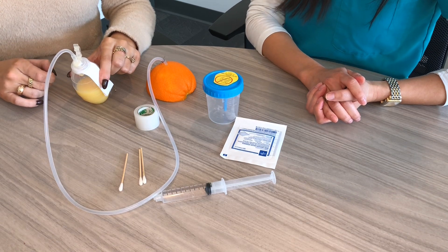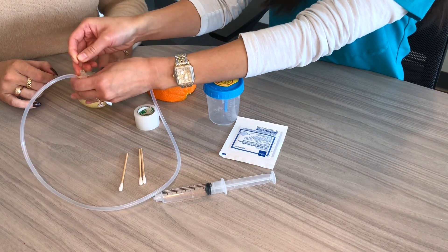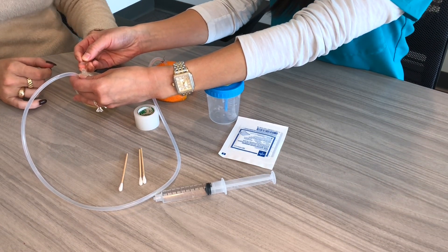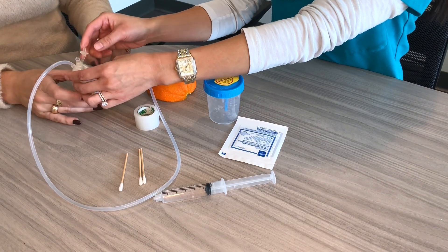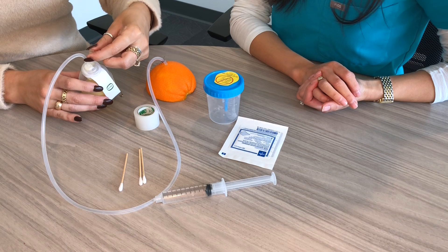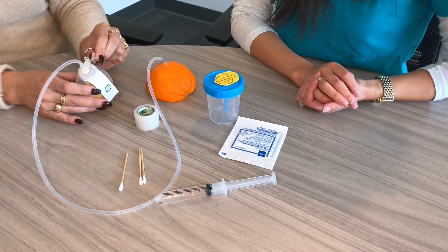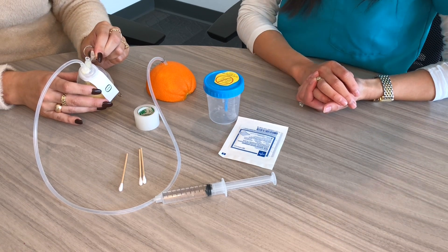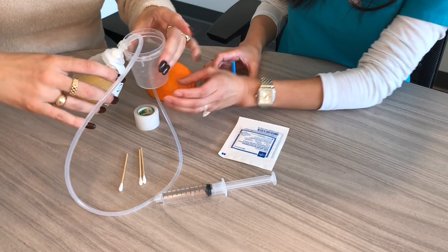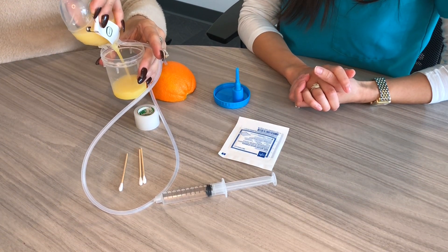Now to empty the drain, open the stopper slowly, pulling it away from you, and make sure you point it away from you so it doesn't splash in your eyes. Empty the contents into the measuring container. We're going to be doing this at least twice a day. Go ahead and squeeze it to empty fully.